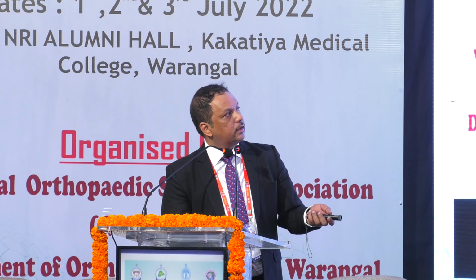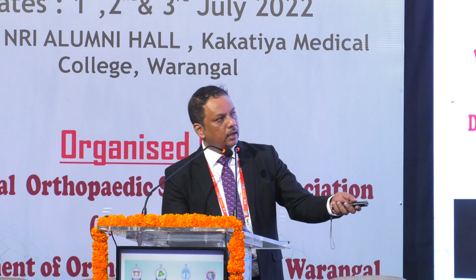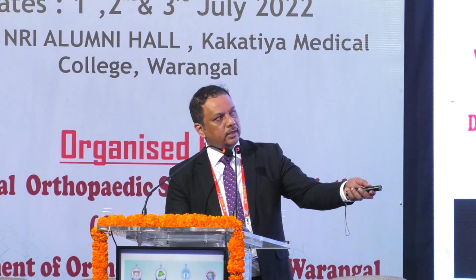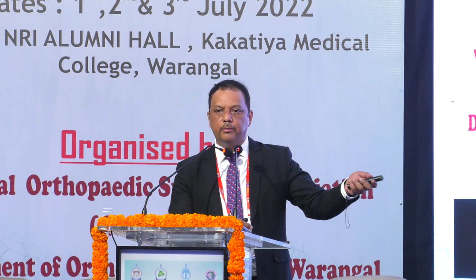Okay, and one of the things you can do is, when you start the case, you can just do a traction view and see where these fragments are falling. And if they are not reducing, see the amount of traction here, right? The midcarpal space is completely opening up. So if you know that this is the amount of distraction required, definitely it's not worth it.